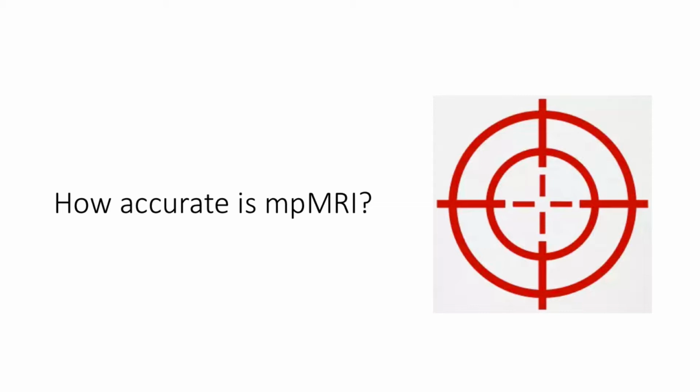It'll just mean more costs for MRI. I think there are studies now looking to see how we can maybe shorten exam time. There are some studies out there on abbreviated protocols, just axial T2 and DWI, very abbreviated. There are studies looking at, can we do away with contrast? Because contrast is not the most important sequence. It's really T2 and DWI.